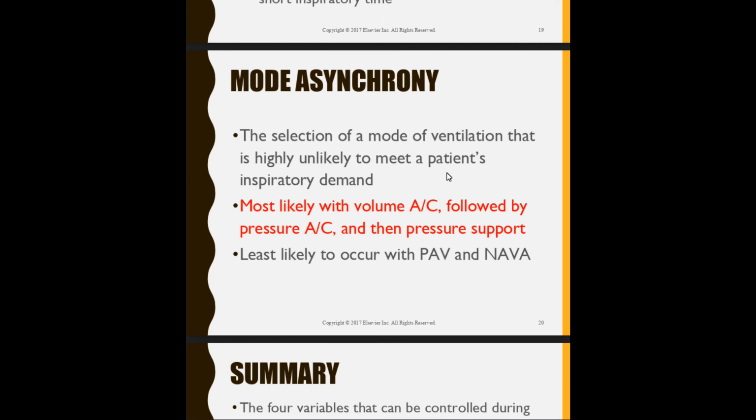So now the body is telling the patient, in a sense, it seems like they want to blow off more CO2, right? Because they are breathing at a faster rate. And that might also be a compensatory mechanism because we're not meeting their demands. So that's why I said switch them to SIMV. If they are on AC volume control and they're doing that, you switch them to SIMV.